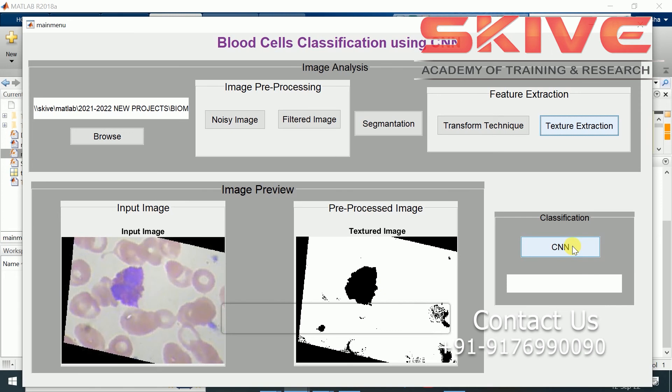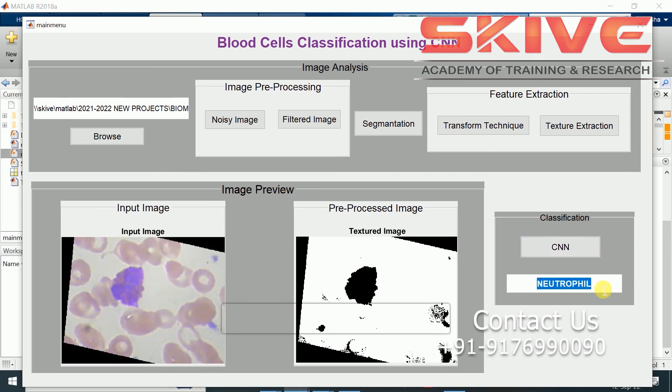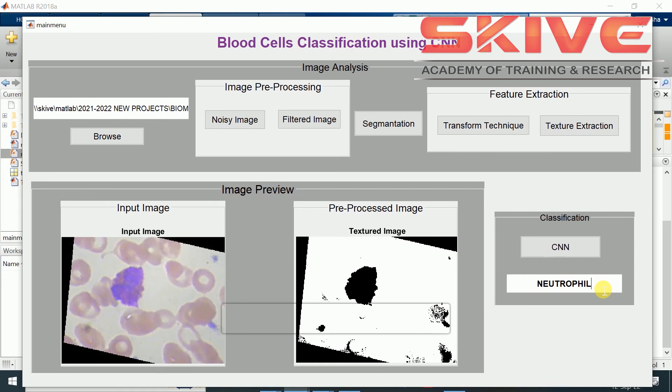Now we can classify the blood cell using convolutional neural network. The result is shown here. By this way we can classify the blood cells for identifying the defects or some types of blood cells.